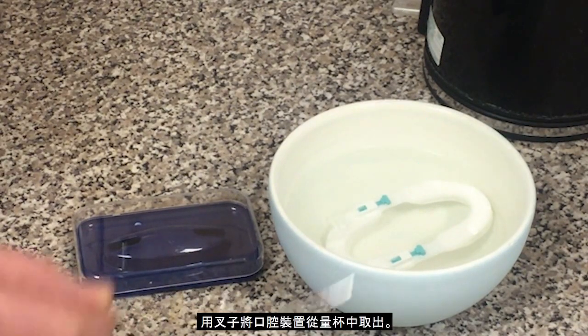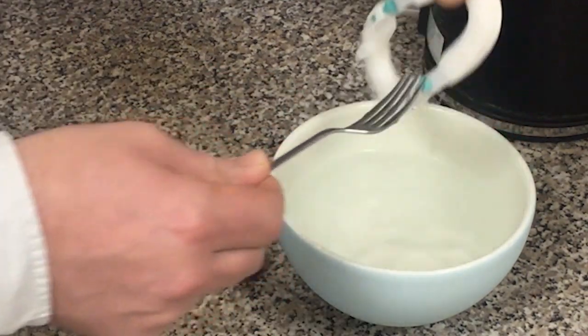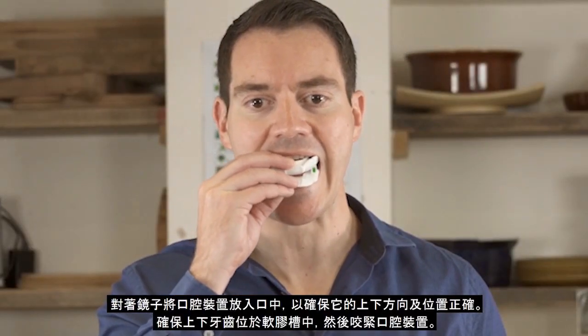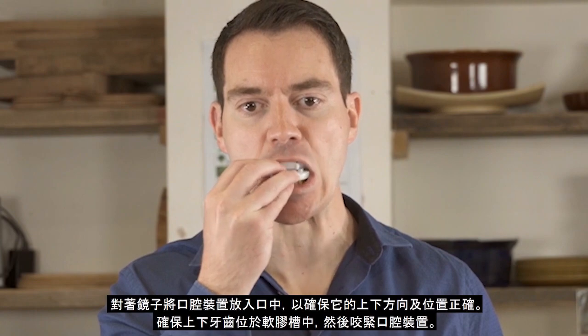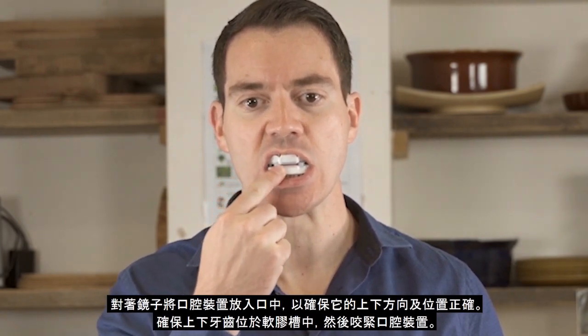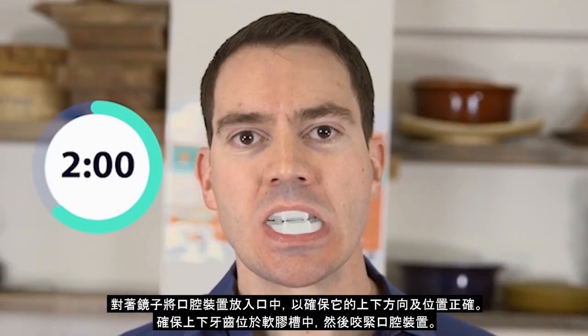Remove the Oral Device from the bowl or jug using a fork. Place the Oral Device in your mouth — you can use a mirror to check it is in the correct position. Ensuring your teeth are within the channels, bite down for 2 minutes to allow the soft plastic to mould to your teeth.